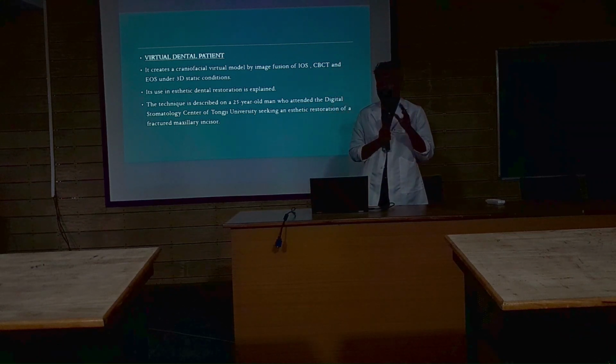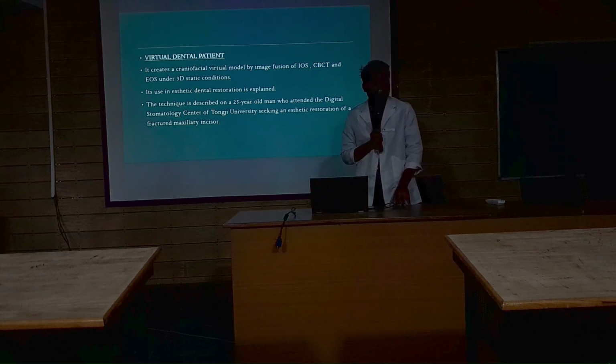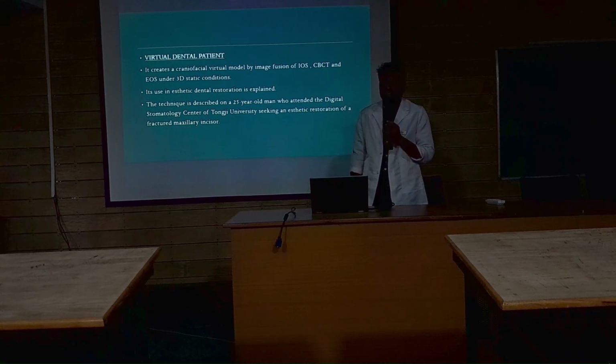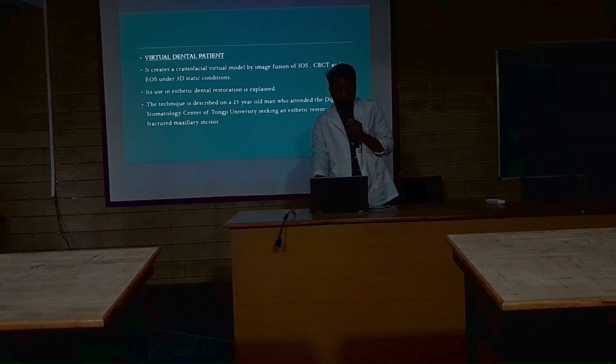We do intraoral scanning, CBCT, and extraoral scanning. Then by using software, we create that patient on our screen, and then we analyze the treatment of the patient. So we have a scenario that we are now showing.